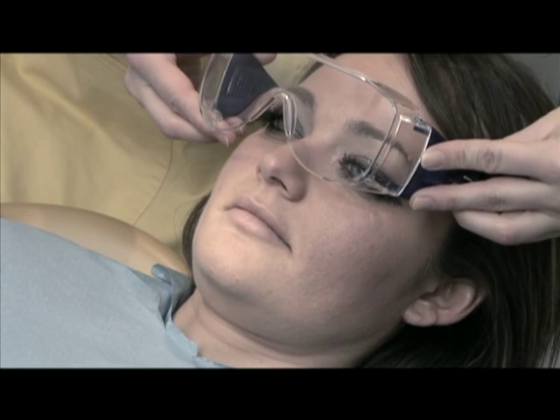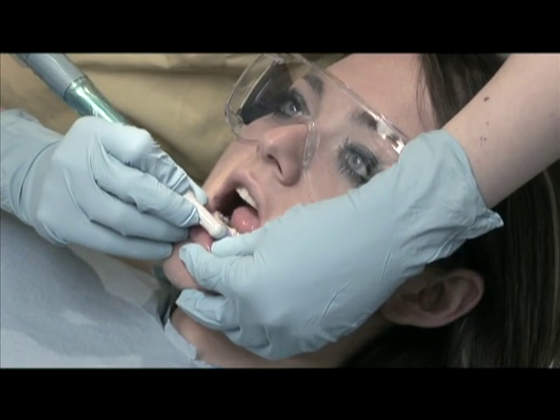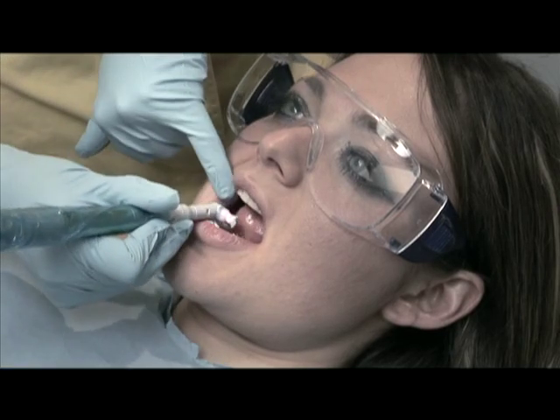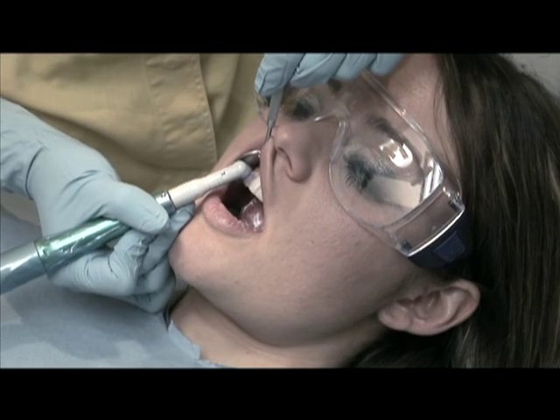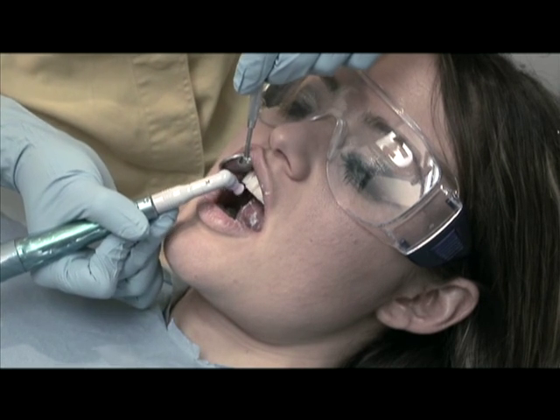Use a rubber cup and a dense mixture of pumice and water to polish the teeth, removing any external pigmentation and the salivary film that may have formed after cleaning. This mixture, unlike prophylaxis pastes, does not contain oily components that might reduce the whitening action.